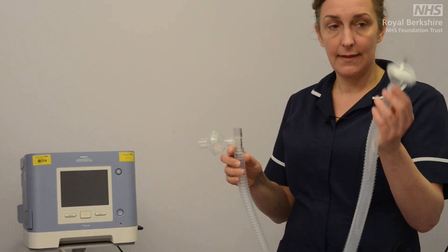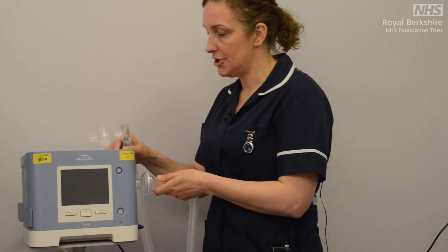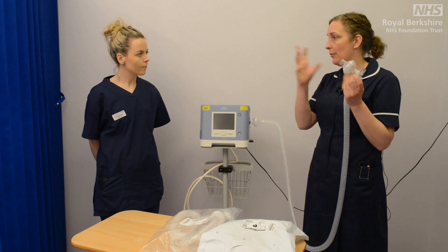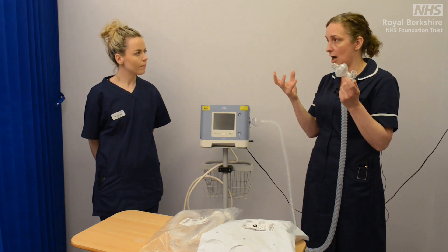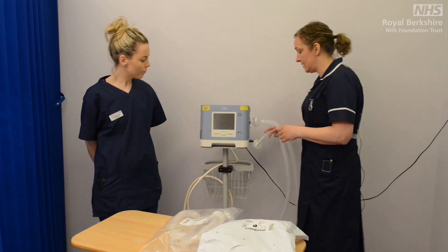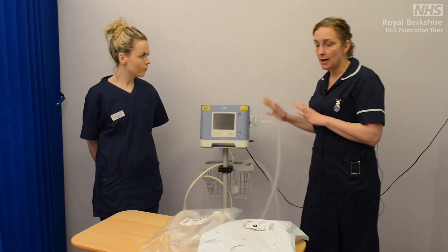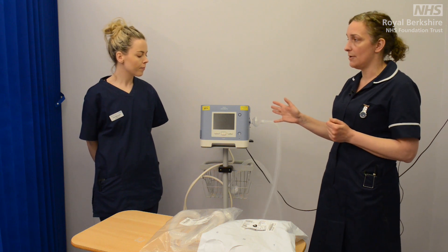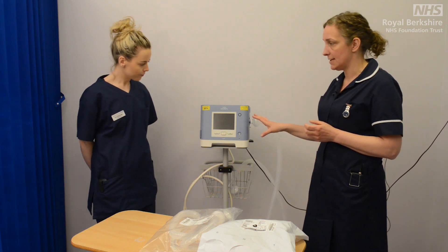Very simply, this end attaches to your machine and this end will be the part that we then attach onto our ventilator mask with our patient. That is the machine set up and ready to attach to our patient. The next thing we need to do now is to set up the actual parameters on the ventilator itself.